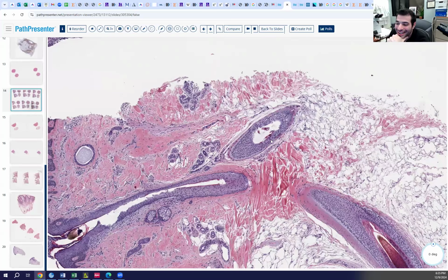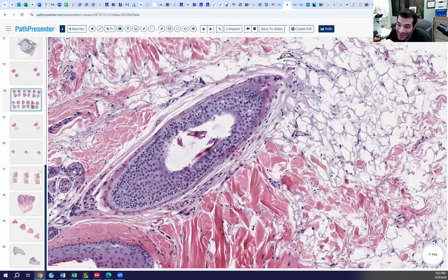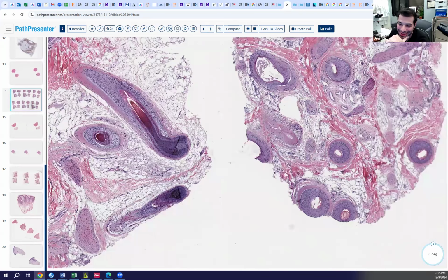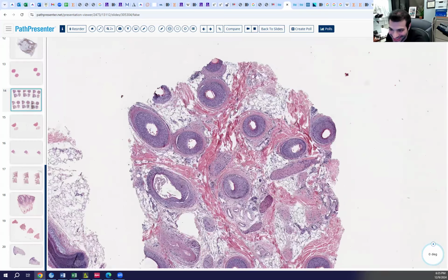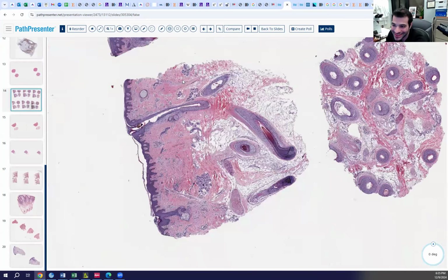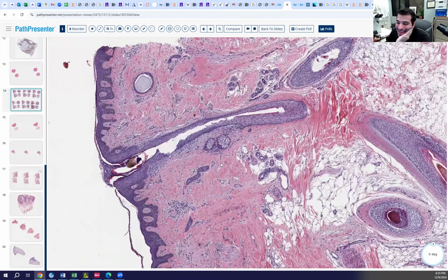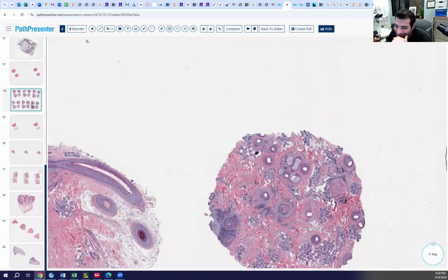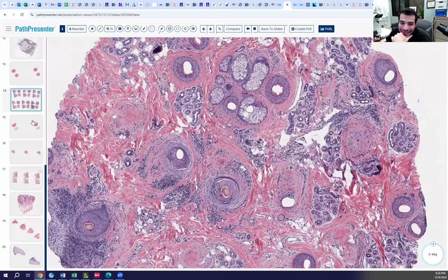So Sperling says the inner root sheath desquamation. I don't know if that's what this is, but just a heads up, guys, if you're signing out with NEAT, don't ever mention premature desquamation of the inner root sheath, because he'll delay sign out for like 10 minutes going on about how that's not a thing. But yeah, so LPP, CCCA, scarring alopecia. And this is what you see over here as well, if this is just giving you more orientation.